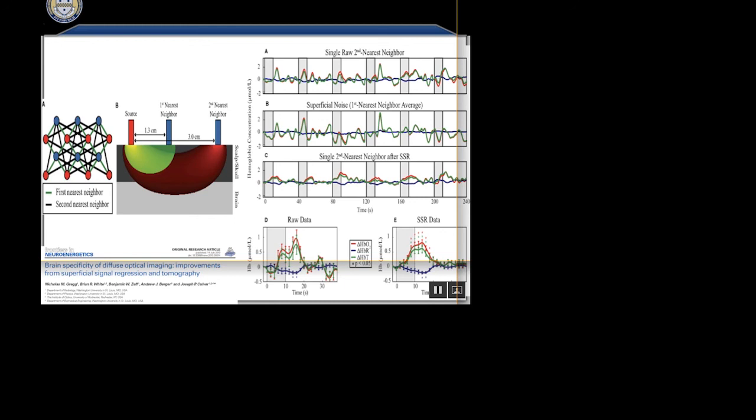These are actually fibers, these tiny little fibers, and that's exactly 8 millimeters. That's why we have it at that distance, so we know we're not going any deeper than we should. There's an ideal distance to get right in the middle of the skin in that area, but if you're shallower, that's not such a problem, as long as it's at least several millimeters. And yeah, this is just the ring itself for the spectrometer, with tiny little fibers here and here.